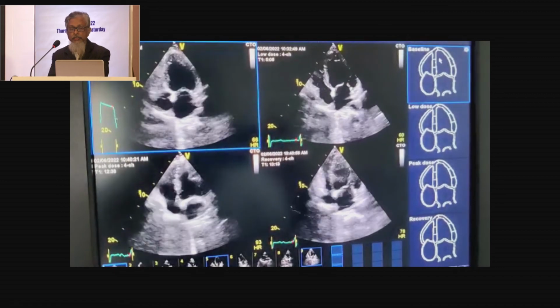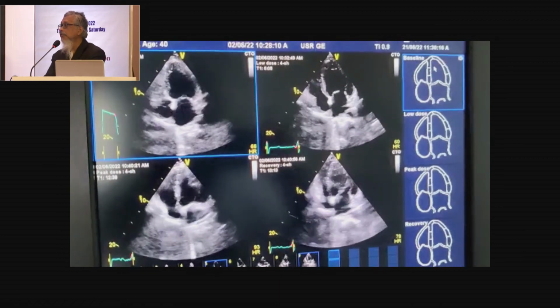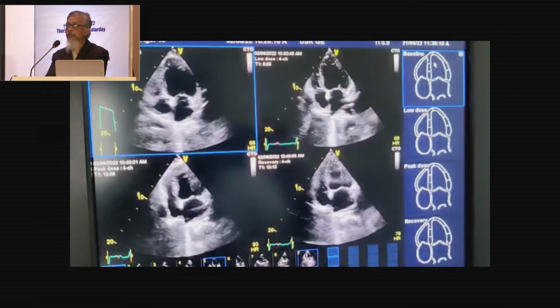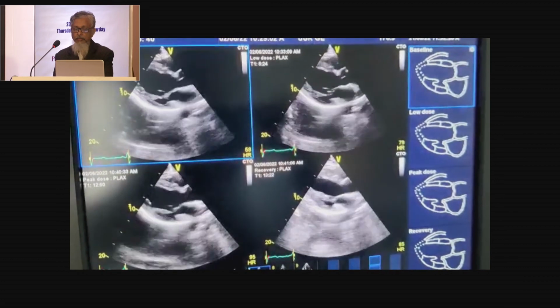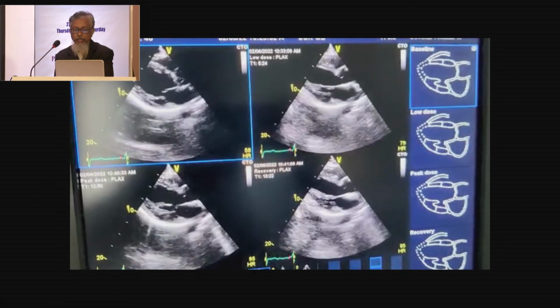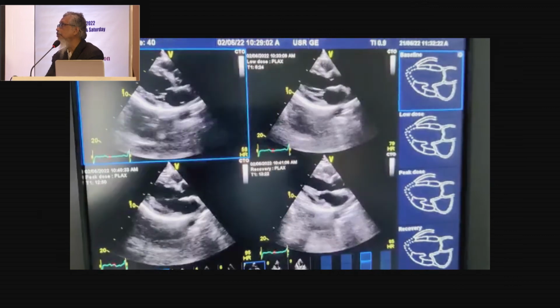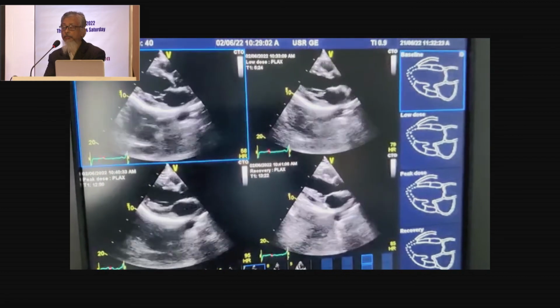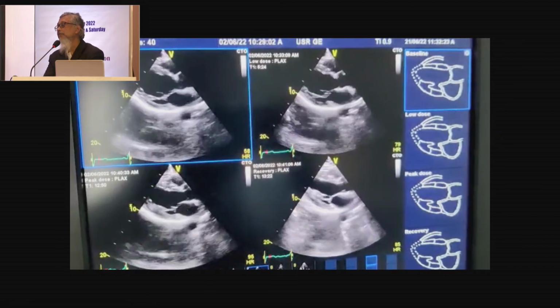So again, for this patient, we arranged a dobutamine stress echo, and as I said, my images are not that great, but you'll be able to find that there was gradual increment of the motion. If you look at the final peak image and compare it with the resting image, there was gradual incremental motion. We call it a monophasic response. Actually, we were dealing with a case of stunned myocardium. We are not dealing with ischemic myocardium. So for this patient, revascularization will not give any benefit.